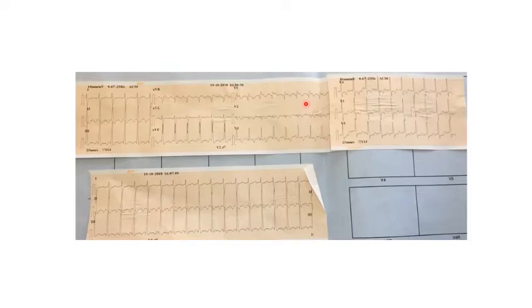Any other differential diagnosis, or would anybody else like to think differently? The axis is 110. Okay, axis. Not 100, so near about, see, AVR is negative. Sir, AVL is negative also, sir. AVL is also negative. Lead one also is negative. So what would be the axis? Sir, more than 90, sir. The transition is at lead one and AVR, so it will be around 90 to 105. Okay, right. There is some degree of right axis deviation. Well taken. There is an RSR dash pattern. Yes, what else?